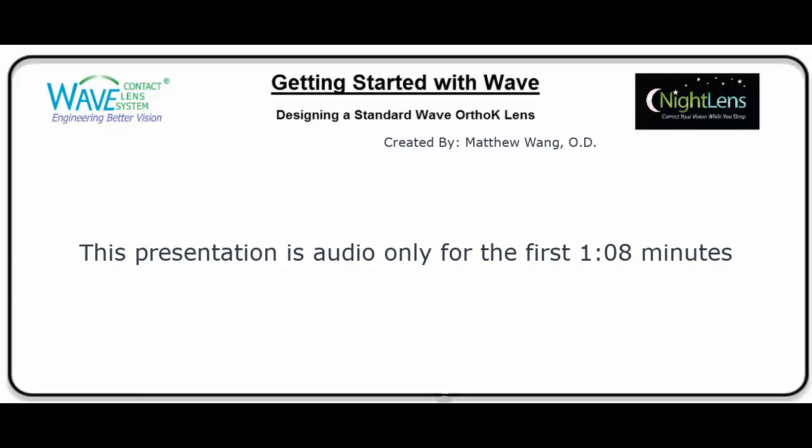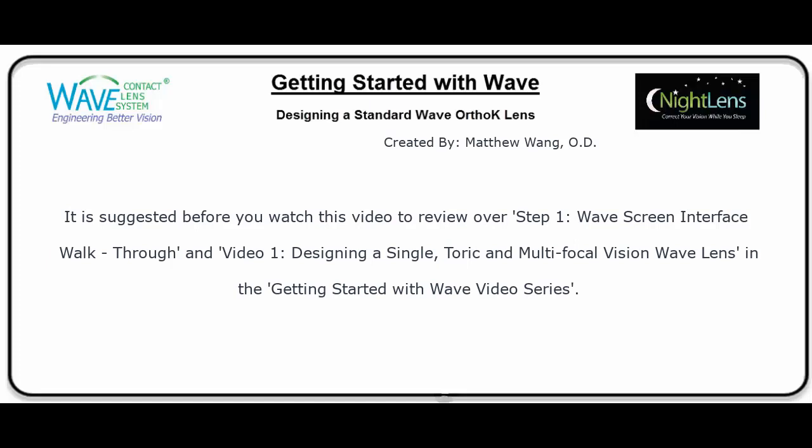In this section of the video series, we'll address orthokeratology lens design and is not meant to be viewed first. So if you have not yet watched the single vision and multifocal training video, please pause here and watch that video before proceeding, as the upcoming principles build on what is presented in the other clip.